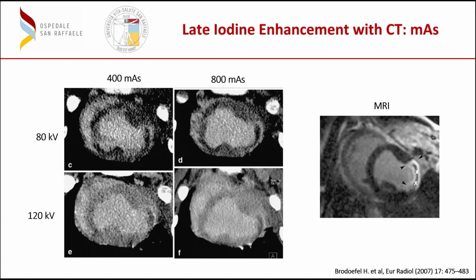To use a low kVp approach, but with the high mAs, because also a lot of photons of low energy, because obviously in this way you can counterbalance the noise related to the low energy of the beam that you have used.